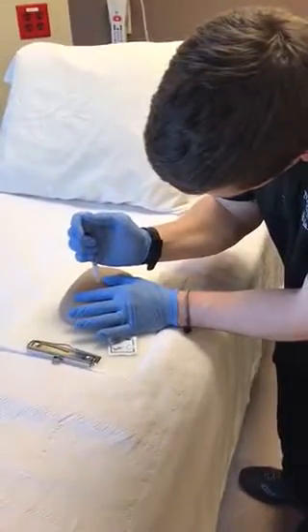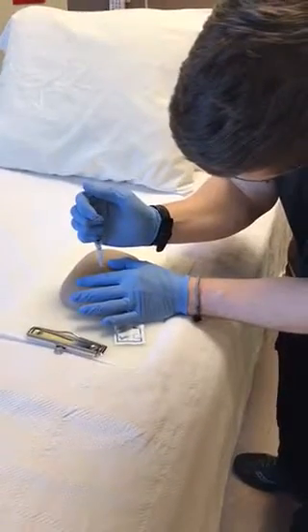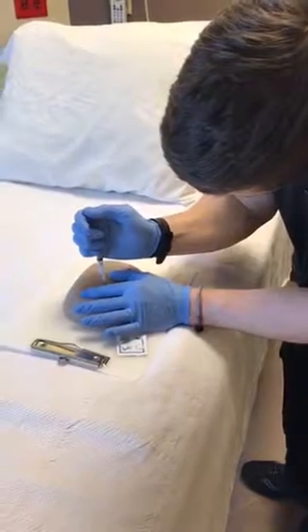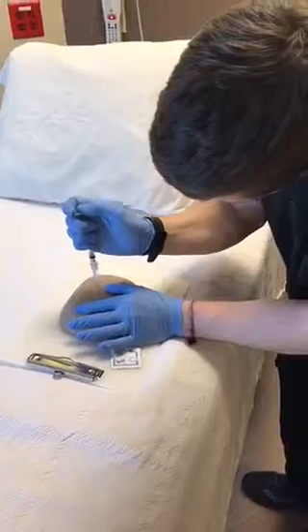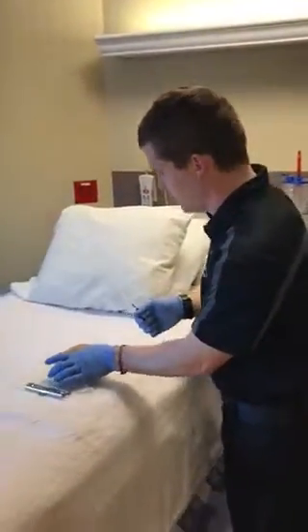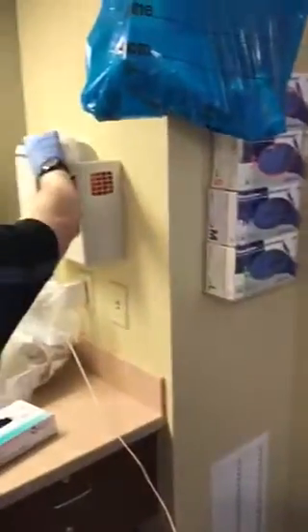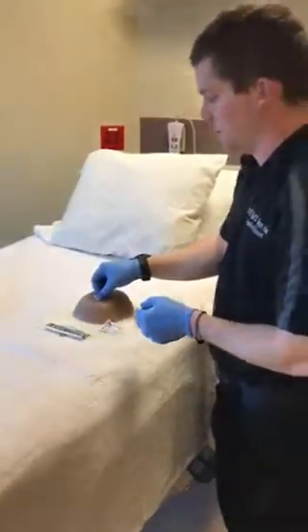Going to withdraw the plunger to aspirate for blood. There's no blood returned, so I'm going to inject the medication over approximately 5 seconds. Hold there for a second, and withdraw the needle, which our patient's arm decided to squirt. And then I'm going to walk this over to the sharps container and come back. If it's bleeding, I can take a dry piece of gauze and blot at it, but not massage, of course.